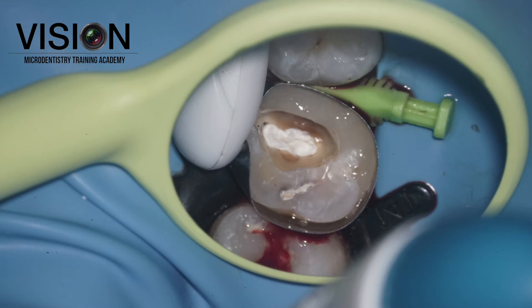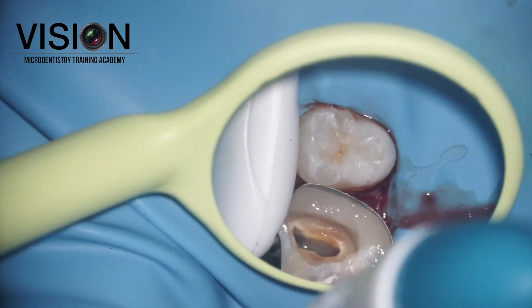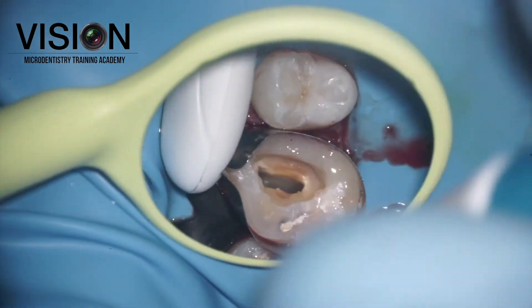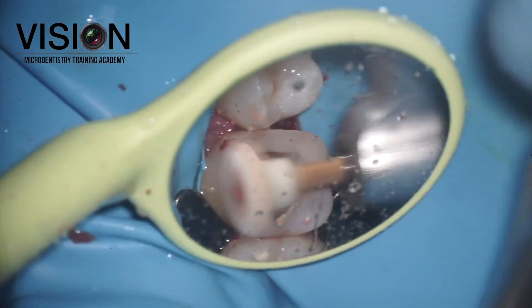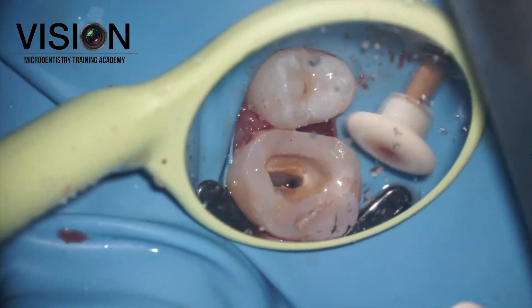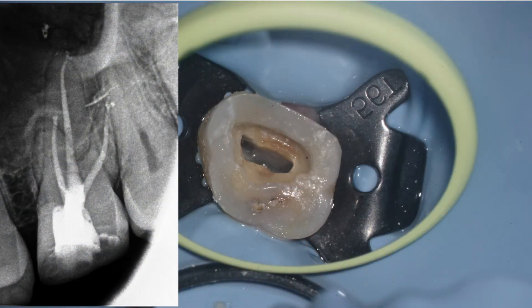The advantage of these matrices is that they can be placed and removed quite easily. Once I have removed my wedge, you can also notice the bleeding starts immediately because of the inflamed tissue. After the matrix band is removed, we have a good clean field where we can continue working. For this particular case, I decided to also finish off the restorative overhangs with the Enhanced System from Dentsply Sirona, followed by continuing the mechanical canal preparation.